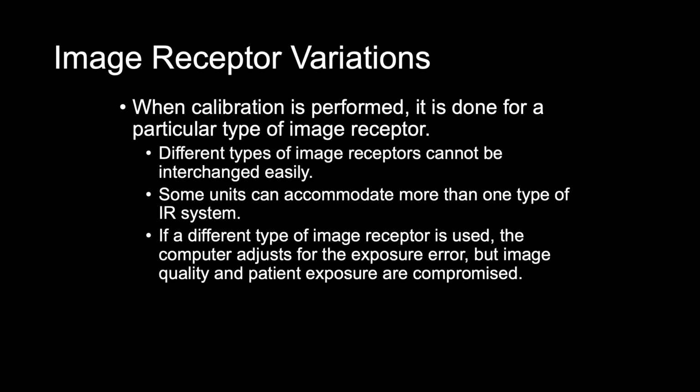The AEC system is calibrated to the type of IR that we're using. So if an IR of a different type is used, the detectors will not sense the difference and the exposure time will terminate at the preset value and the image quality may be jeopardized.